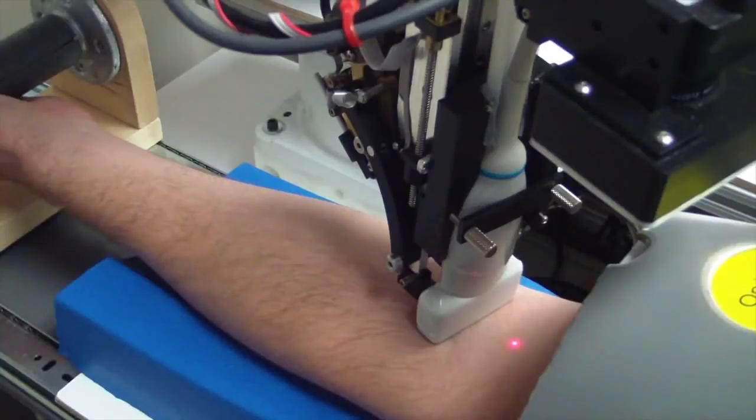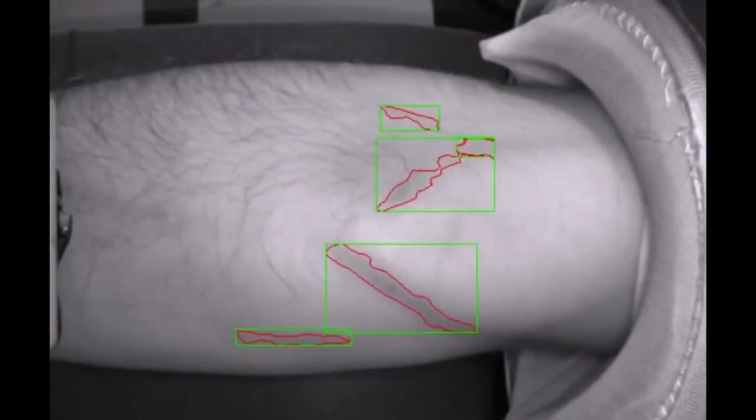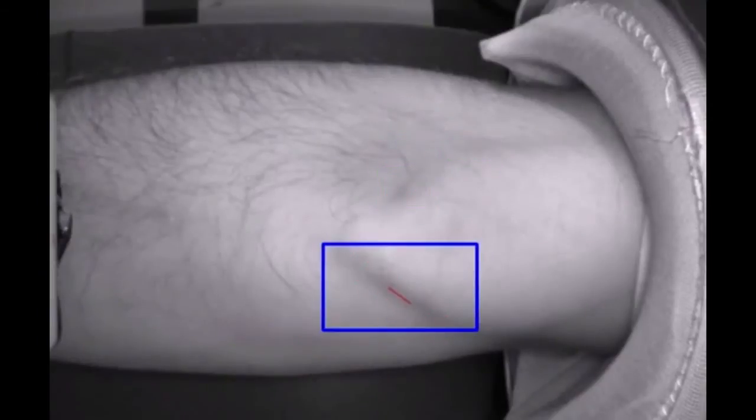After the patient puts his arm through the archway, an infrared light illuminates his inner elbow for a camera. Software matches what the camera sees against a model built from thousands of vein images, looking for a suitable vein.